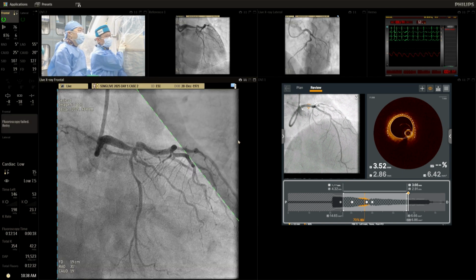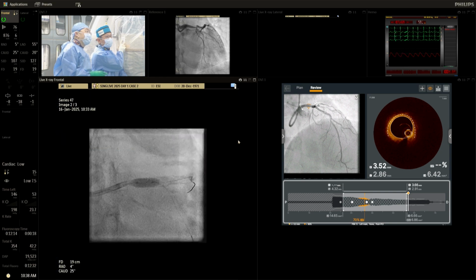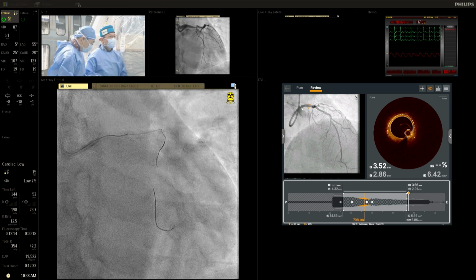Okay, have we done a shot? We haven't done the cine yet, actually. Do we? No, we haven't. We'll do a cine for you here.